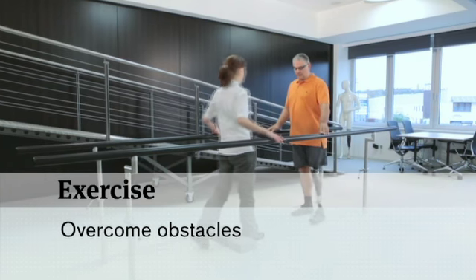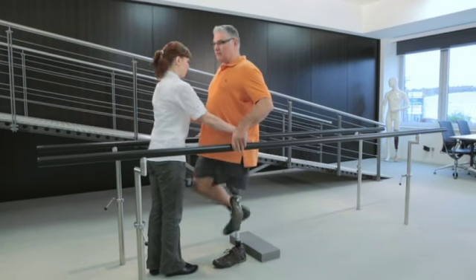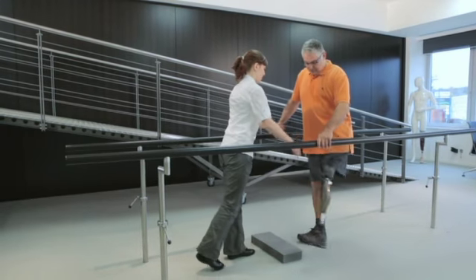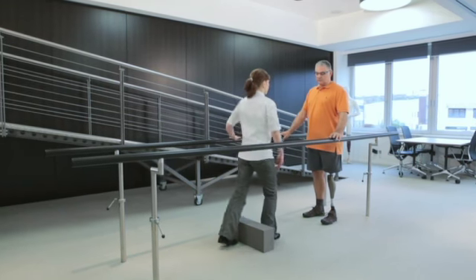To help train your user, have them take the first step with whichever side is more natural for them. The activation of this function is similar to activating the stairs function. So, load the extended prosthesis. Extend the hip. Flex the hip with a snapping motion and load the prosthesis. You can have the user practice stepping over obstacles of various heights to build confidence.